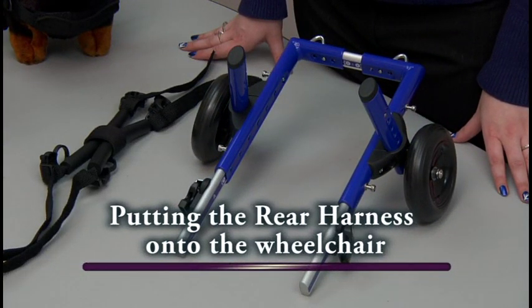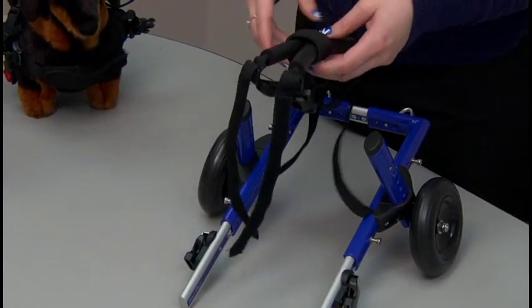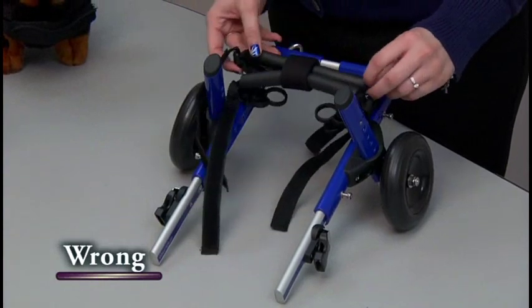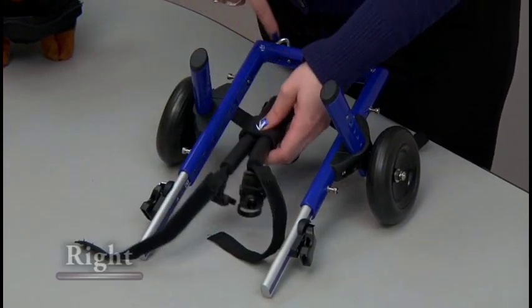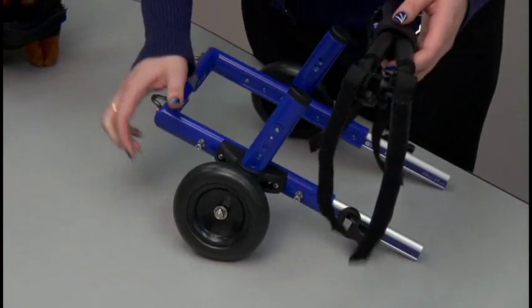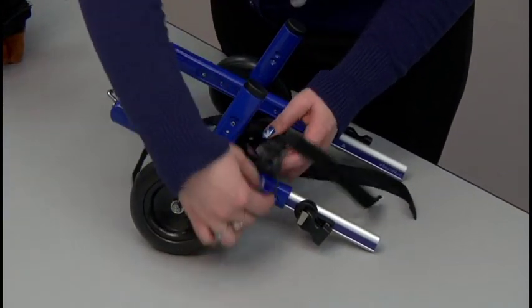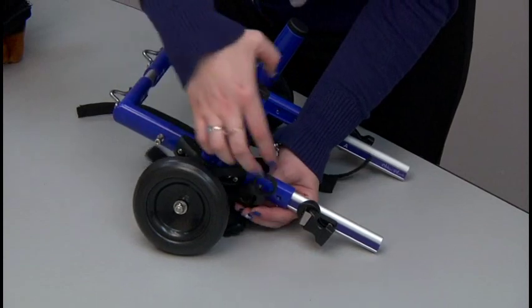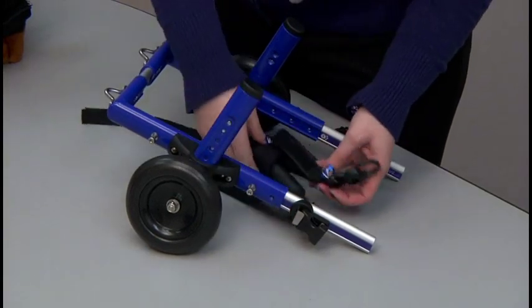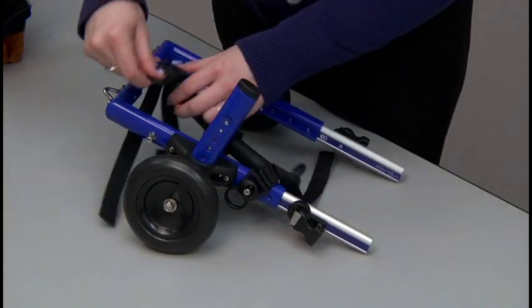Now I'll be demonstrating how to put the rear harness onto the wheelchair. The rear harness that comes with the wheelchair is the leg ring style harness. When you put the leg rings into the wheelchair, make sure they're going along the side of the wheelchair — not from left to right, but going along the side with the extenders. When you put it onto the wheelchair, make sure that the harness clips go over the side of the wheelchair, not from underneath. Going from underneath is the incorrect way. Make sure the harness clips are going over the side and clipping in — you can hear them snap in.